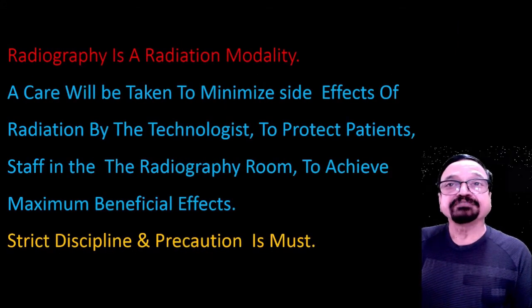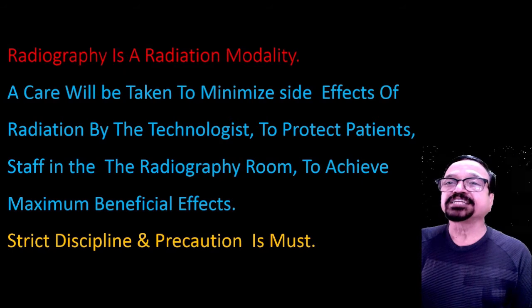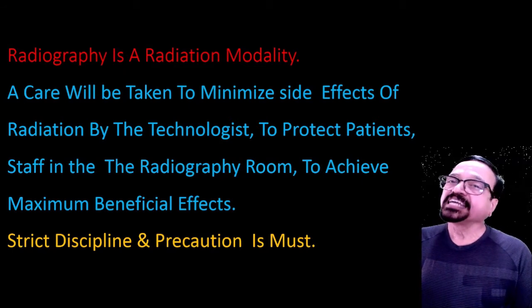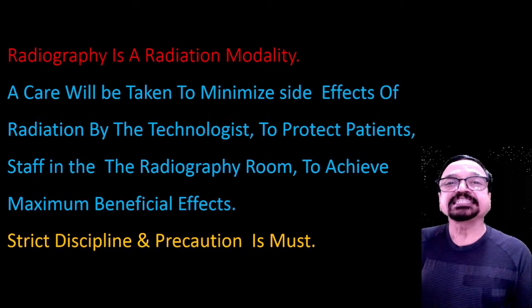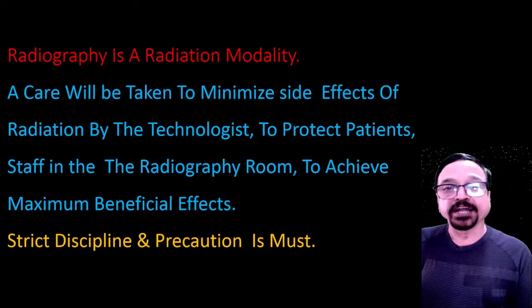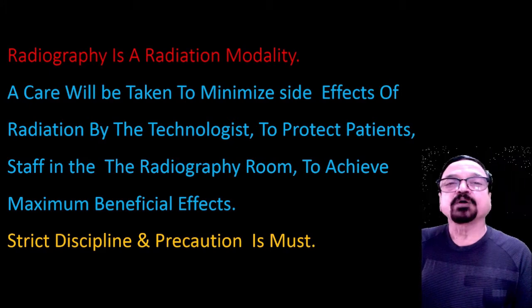Now radiography is a radiation modality. Care has to be taken to minimize the effect of radiation, and the care of the patient, the attendant and the staff working there is taken by the technologist. But it is also important to follow the instructions written on the board in the department and whatever has been told by the technicians. The technicians also follow the ALARA principle to give the patient the minimum possible radiation. They also take care that certain parts of the patient which are not of radiographic interest are covered and protected.